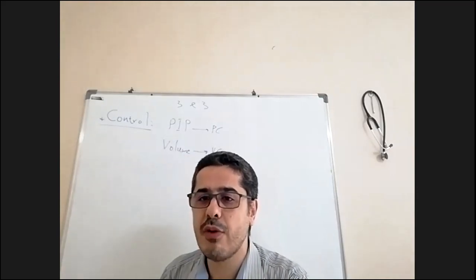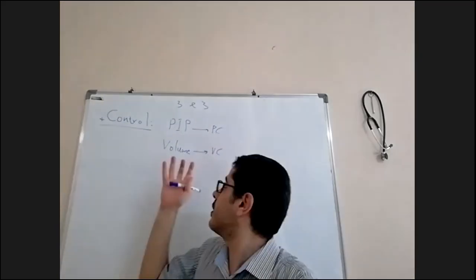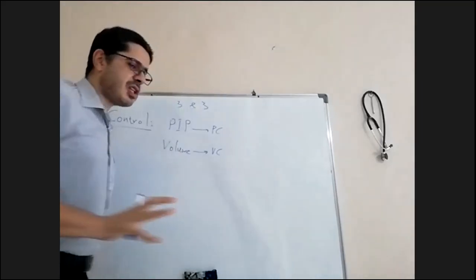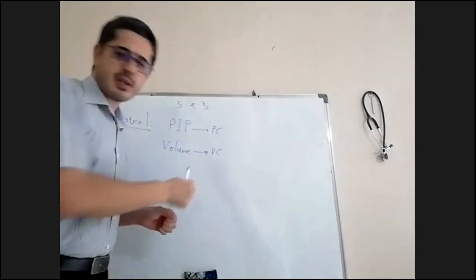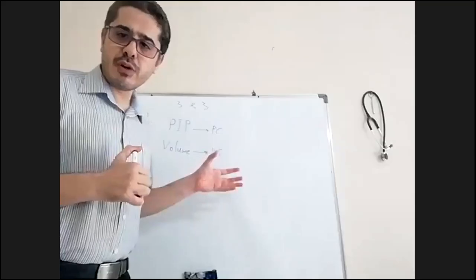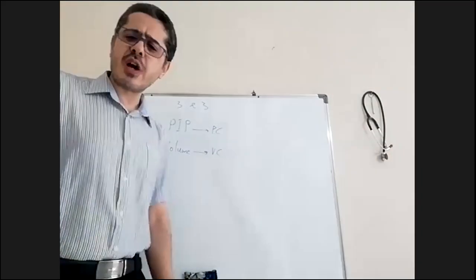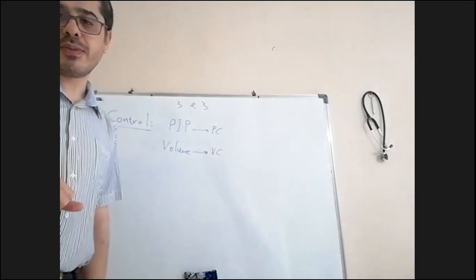On the other side, the advantage of volume is that you can control and guarantee the tidal volume. But there is a risk of barotrauma. Why? Because I always tell you the ventilator is like a polite, respectful person. Whatever setting you put, the machine will do. If I want to give a certain tidal volume and the patient has poor lung compliance, the ventilator will keep raising the pressure to a very high level to achieve the tidal volume. In this case, there is risk of barotrauma.